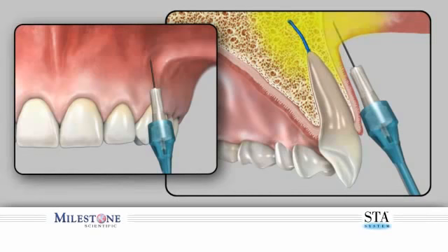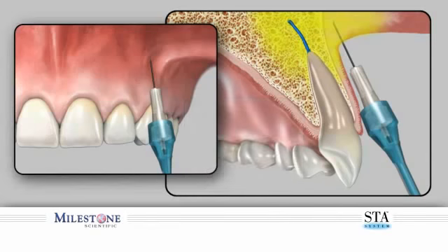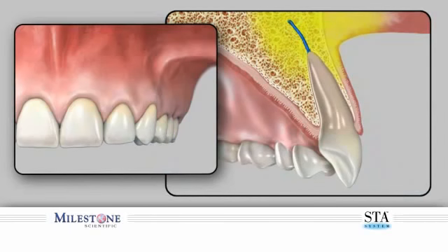To avoid anesthetic solution spray back into the patient's mouth, perform the following. While the needle is still embedded in patient tissues, depress and release the foot control pedal. Count 3 beeps after releasing the foot control and then remove the needle from within the patient's mouth. Direct the needle away from the patient, as a small amount of anesthetic solution may still be present. Should you require more than 1 anesthetic cartridge, you can reload subsequent cartridges and continue as required. Please see the section on multi-cartridge technique.